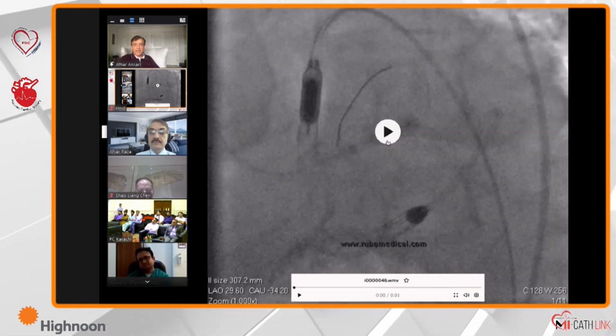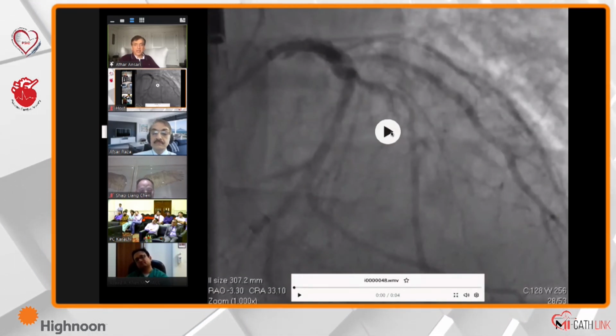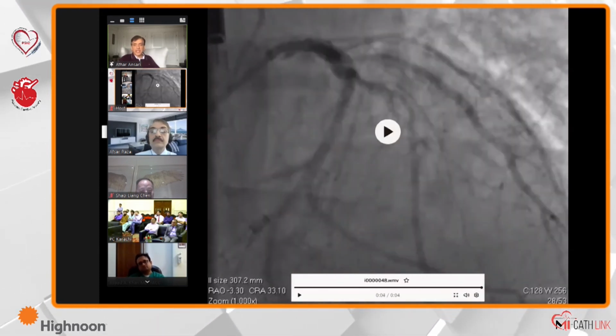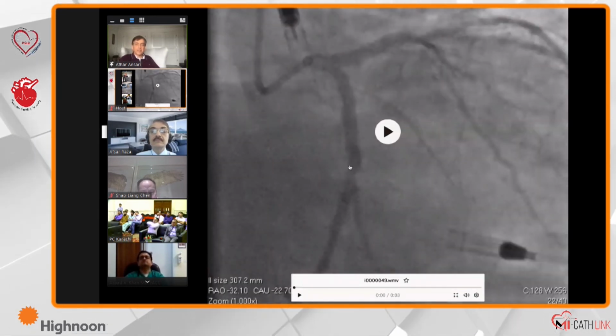And finally, this is what we got at the end. I'll show you. Here we go, the left main, LAD. There's some diffuse disease on the LAD here, which I left alone. I didn't want to be too fancy. And here we go, that's the final picture.